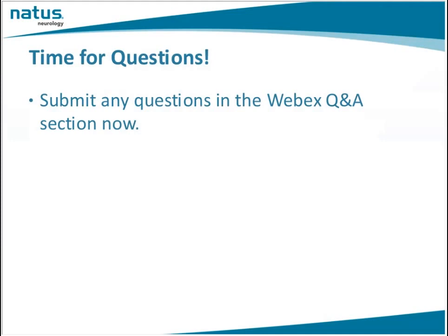He is asking if you could explain a little bit more about the PI, or the pulsatility index. Well, in the STOP study, we actually did not use the pulsatility index numbers. I know that they're used a lot when we're looking at renal artery stenosis and many other areas of vascular disease. We mainly used the pulsatility index to indicate whether we felt there was resistance to flow downstream.